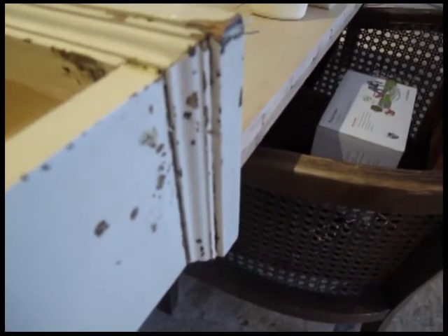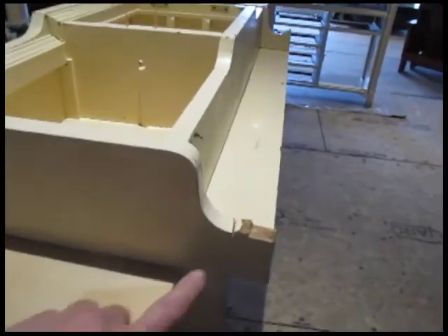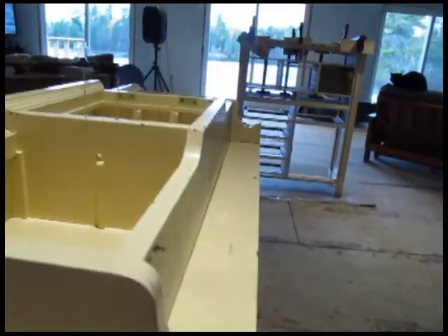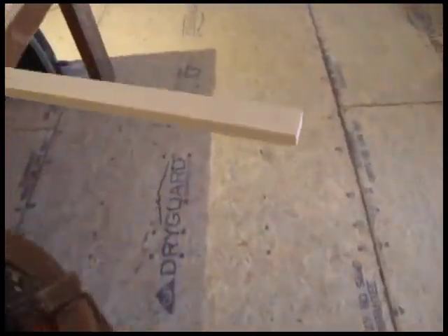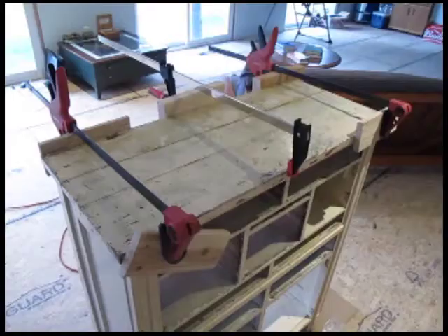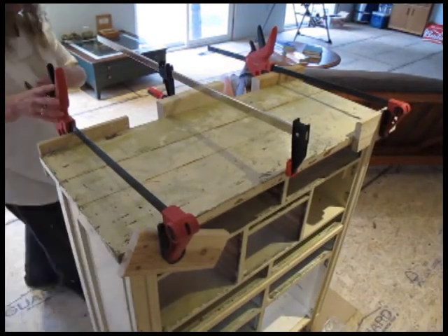I put that little piece of trim back on, glued it, and put a nail in. I did a little tiny start on the little piece I'm taking out here, so you can see that's been measured off so that we can get rid of it and put in a proper piece of wood. So we've purchased the wood, and all I need to do is cut off 1.5 inches and make that pattern right there. All right, let's see if I can do a better job at taking the clamps off than I did at putting the clamps on.